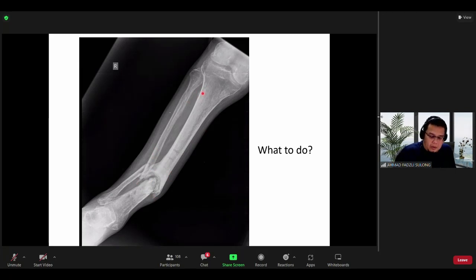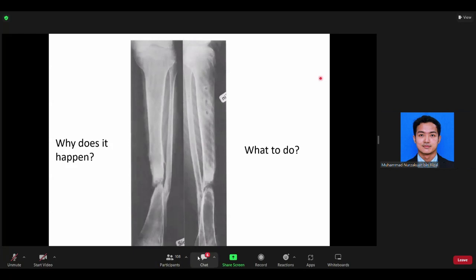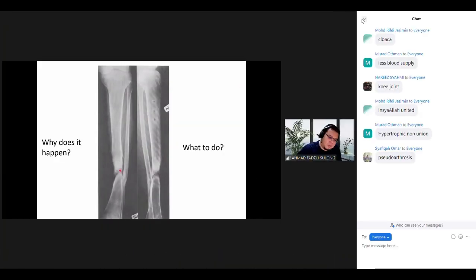Alright, okay, so how about this? So kita dah termasuk ke gambar ni. Sekejap, panggil siapa? Panggil ni lah, panggil jantan pula, Zakwan. Oh, Zakwan, Muhammad Nur Zakwan bin Rizal. Ya, Mister. Ada. Ada. Okay. Ni united atau tak?